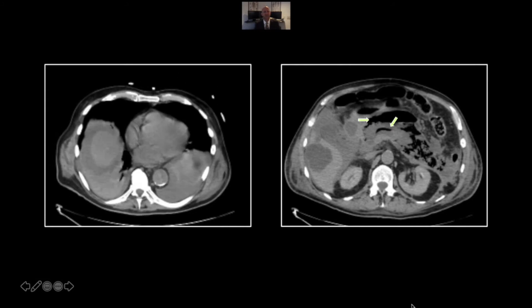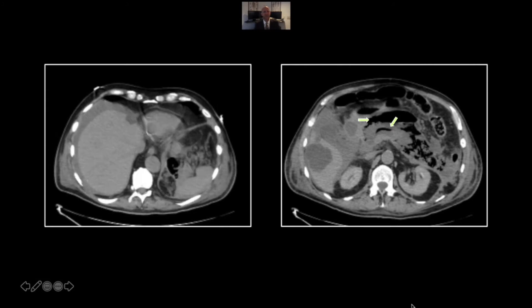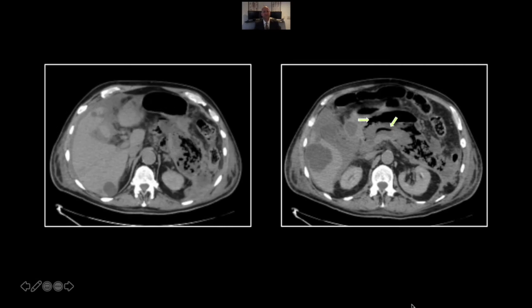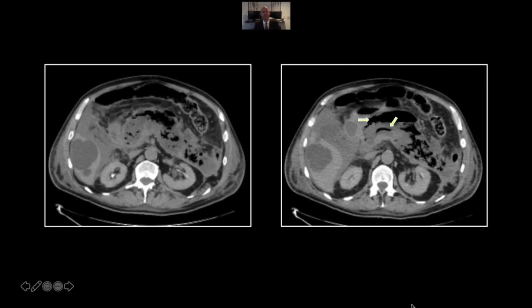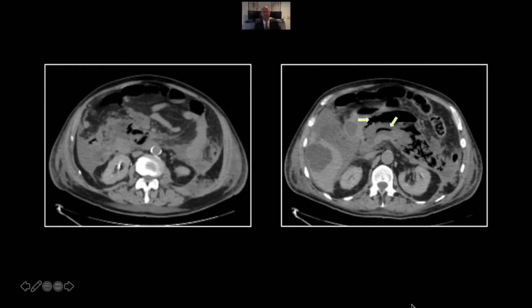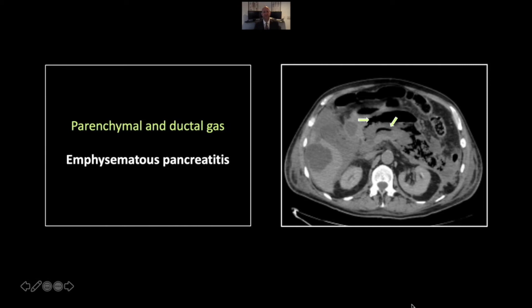This is one you're unlikely to see of this extent, and unfortunately this patient did not survive. That is a case of emphysematous pancreatitis.